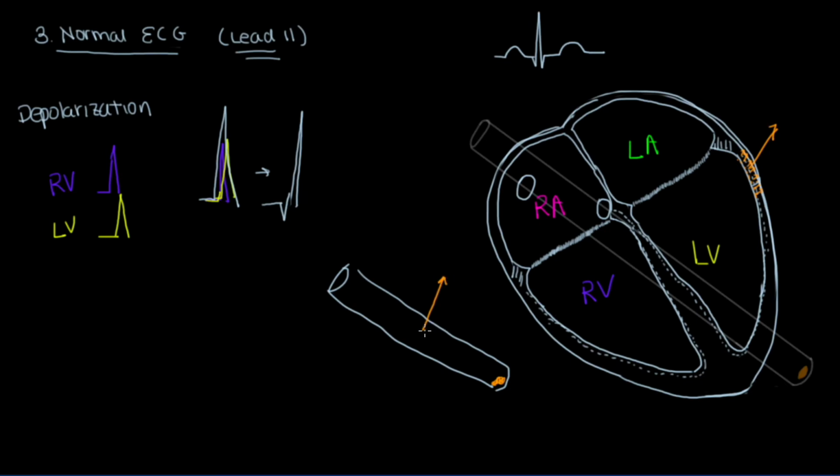So again, you'll break it down into its perpendicular component. The perpendicular component's like this, and then the parallel component to the axis is coming like this. The sensor is not going to be able to see this perpendicular portion, only the portion that's parallel to it. So you have a slight negative deflection actually.